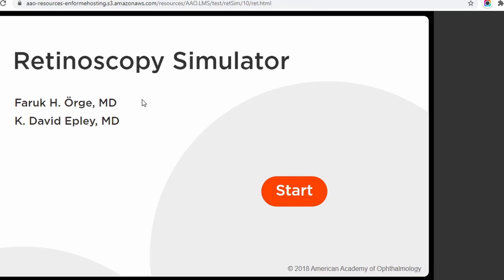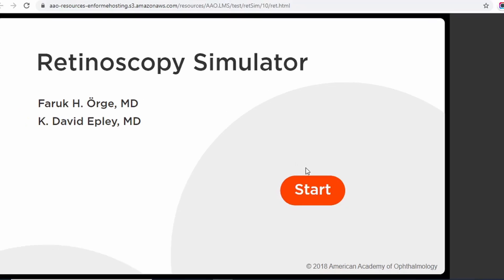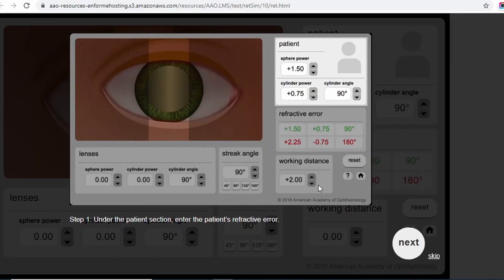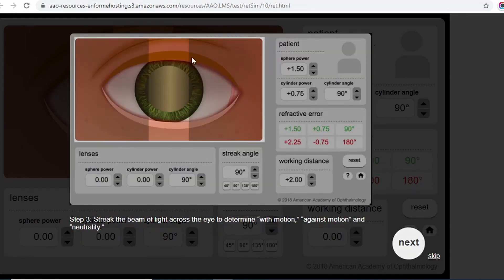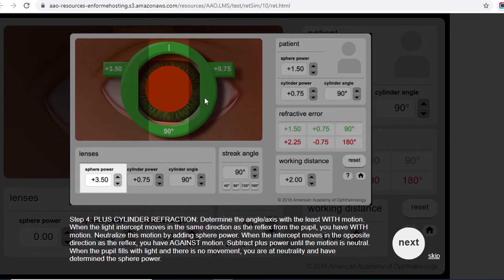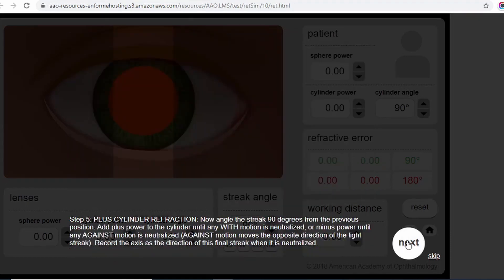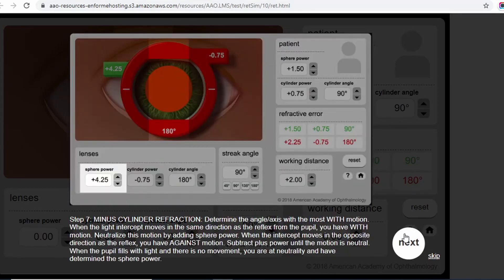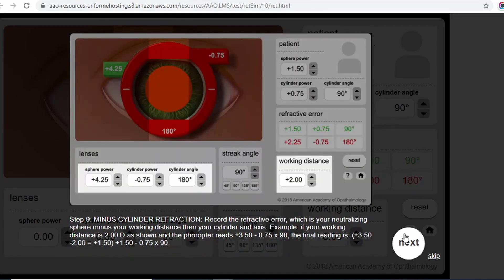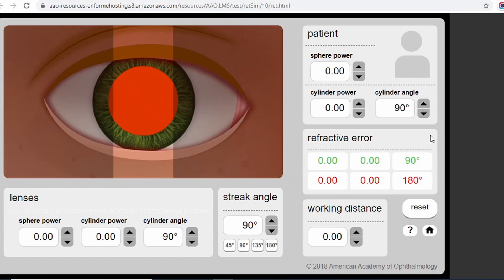This is the retinoscopy simulator by the American Academy of Ophthalmology. Click on Start and you will see a screen where you can get information. It shows the patient section, the working distance section, the retinoscopy streak with and movement, trial lenses with cylindrical power, axis, and streak angle. You can follow the procedure stepwise.